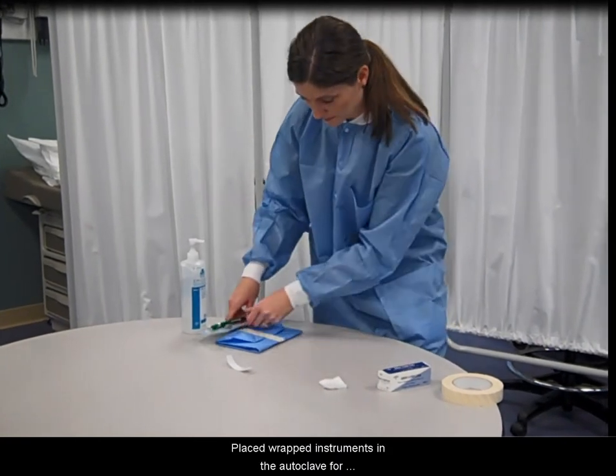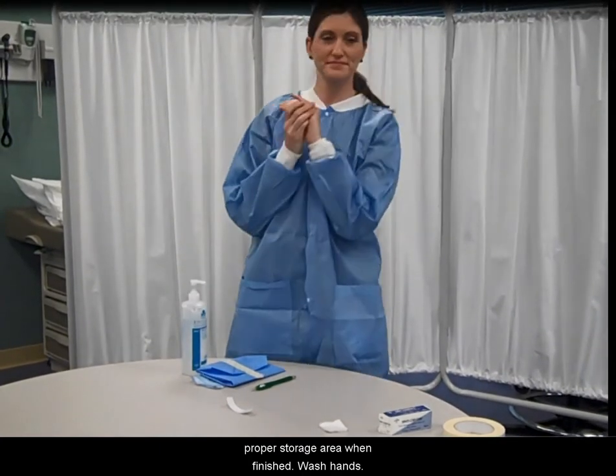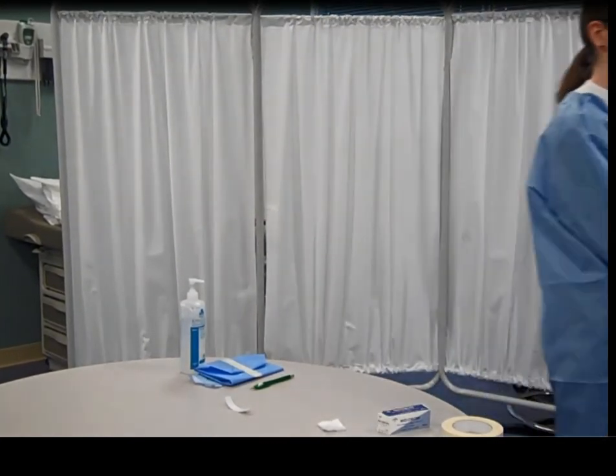Place wrapped instruments in the autoclave for sterilization and return all unused supplies to the proper storage area when finished. Wash hands.